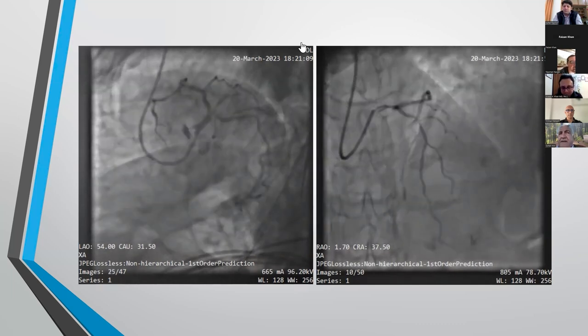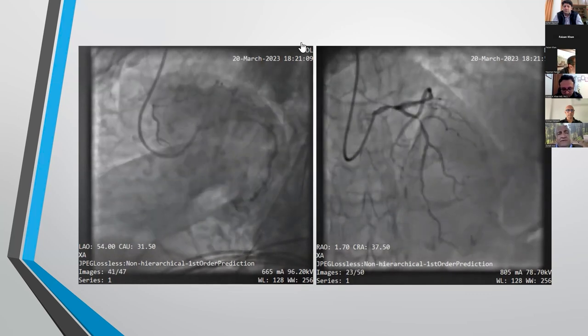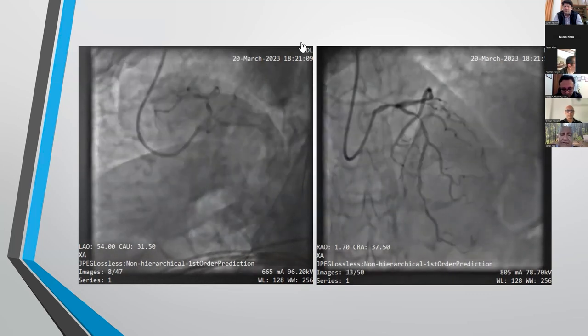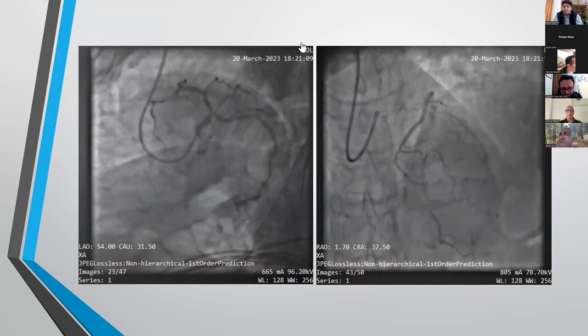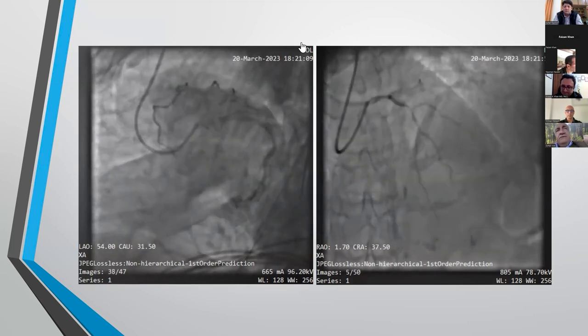What we just start doing nowadays is that once we get a diffuse disease distal to the stent, we use a DCB to coat that area. I'm not sure if it'll help us or not, but it does look good if you run an IVUS on it. And we can show you some cases. We've had some great results when we try it in diffuse disease.